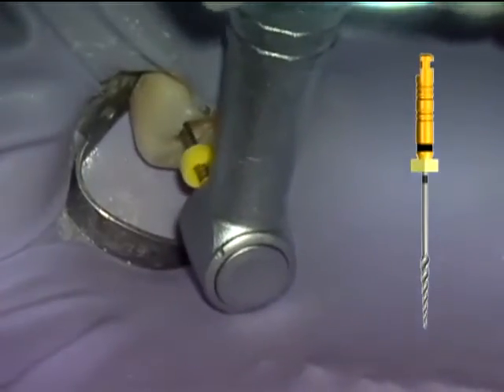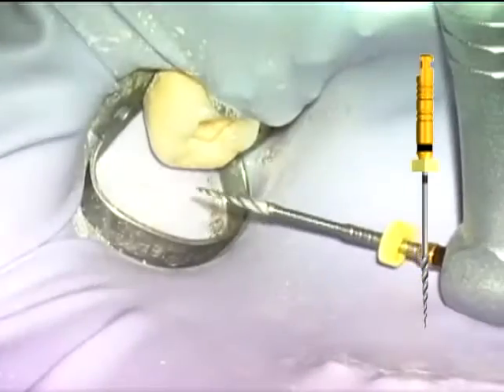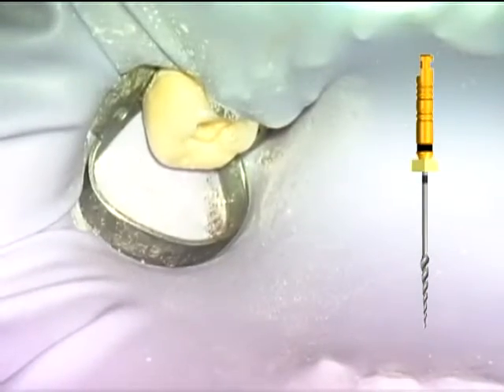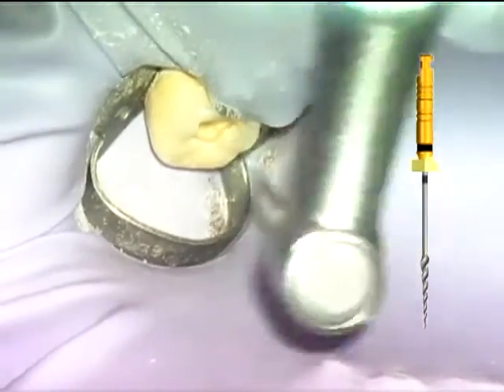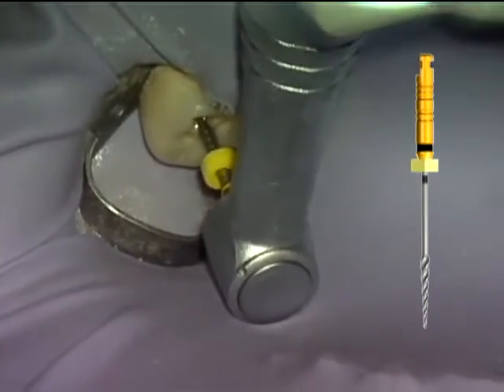While a 4008 shape is certainly adequate for a medium-sized canal, I personally prefer a bit more coronal enlargement in these roots, so I will finish with a 4010 standard GT file, as it has a 1.25 mm maximum flute diameter.